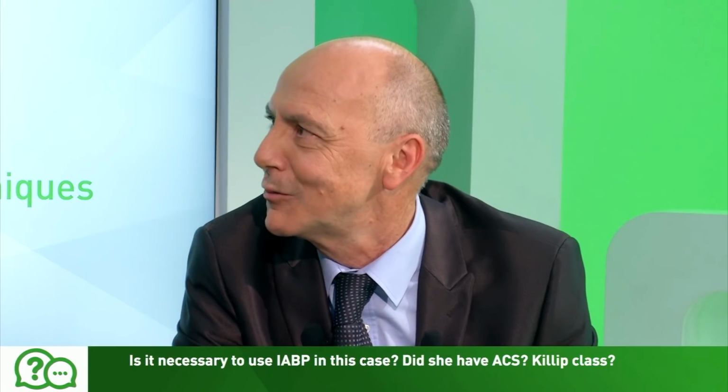I don't think it was necessary, but as I mentioned, I saw that tight lesion, and I felt much more comfortable doing it with the balloon pump, even though, of course, I recognize that if this was a bad LV function and the patient hemodynamically crashed, the balloon pump would not bail you out because you have to have a rhythm.